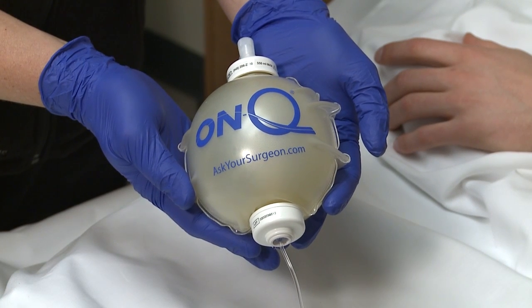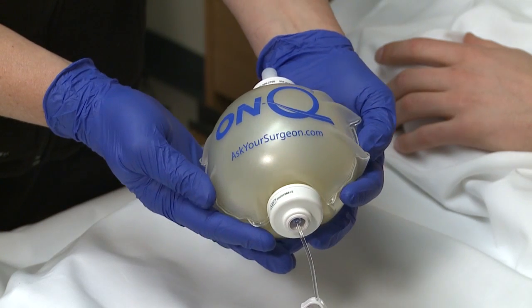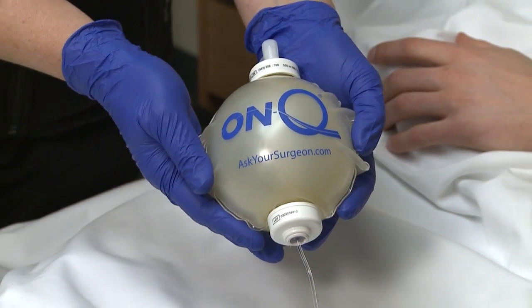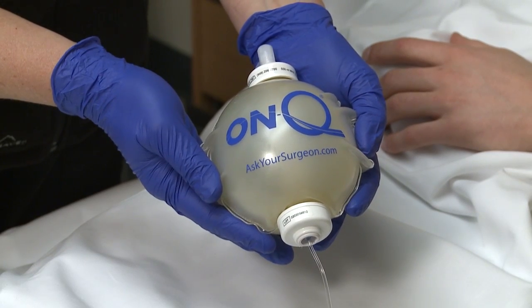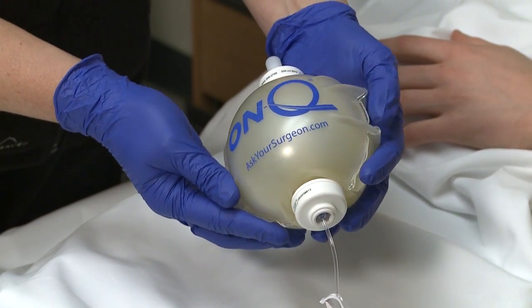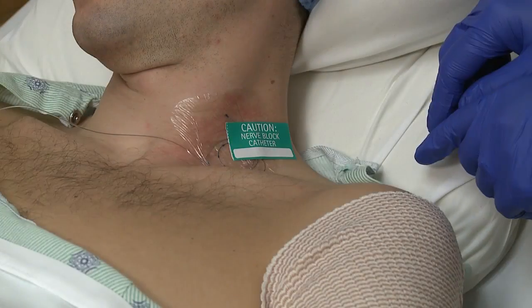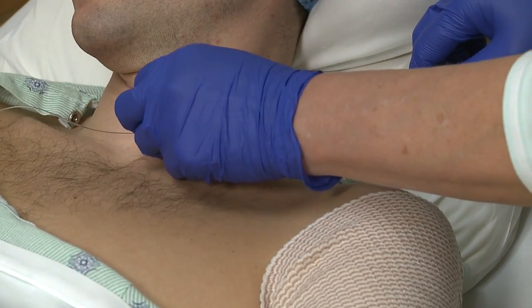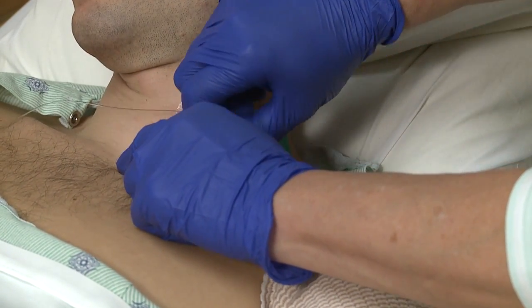The medicine in the pump typically lasts about 2 to 3 days. During that time, a physician anesthesiologist or a nurse will call you to make sure you are doing well. After the infusion stops, you may still need to take some pain medicines as you continue to heal if you weren't already doing so. You can remove the catheter after the numbness is worn off and you have full feeling in your limb. The removal is very simple and painless.